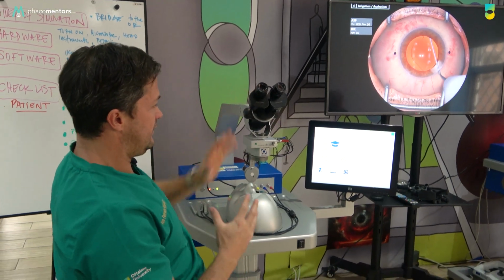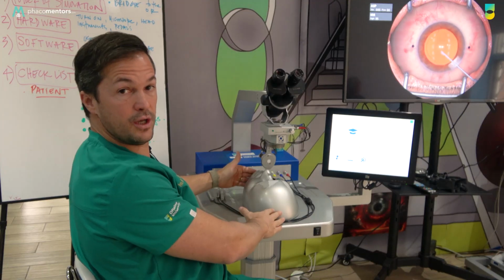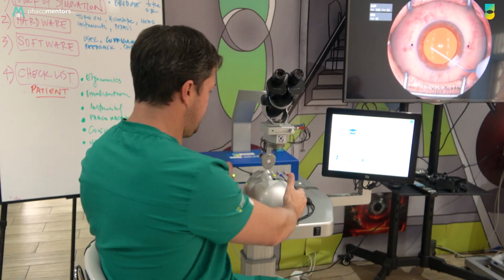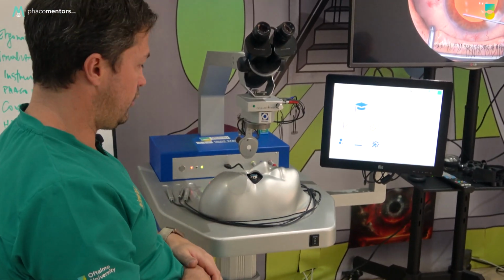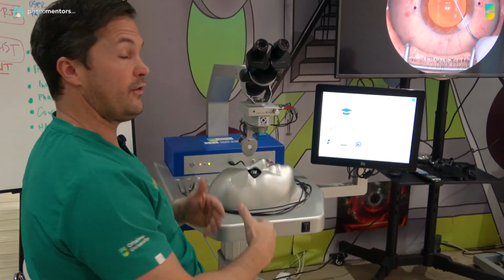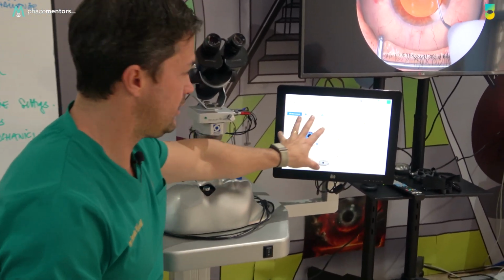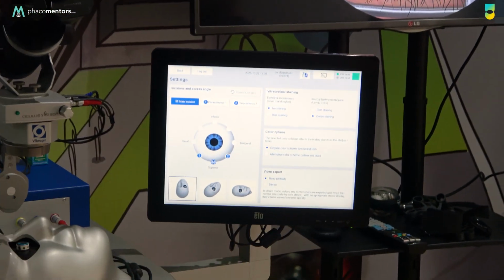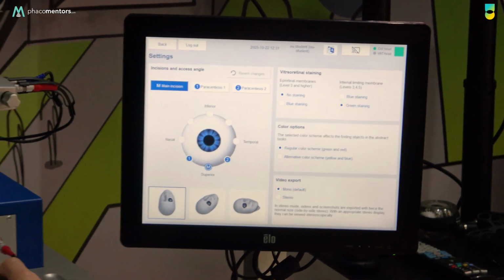When you have this perfectly, then we need to go to the head of the patient and we can choose if you're going to have a frontal approach or a temporal approach. You can have those 2 different approaches that are going to change everything, and we're going to see how in settings right here you're going to manage that frontal approach or temporal approach. Let's go with a frontal approach in this case.